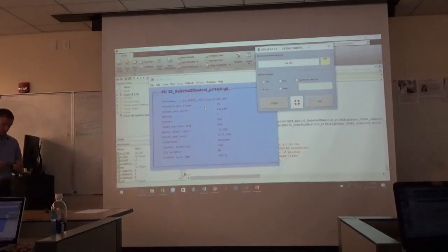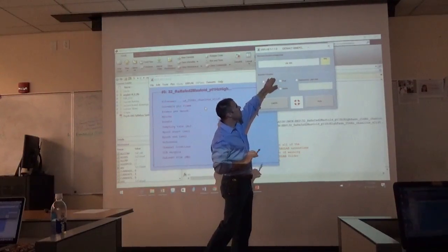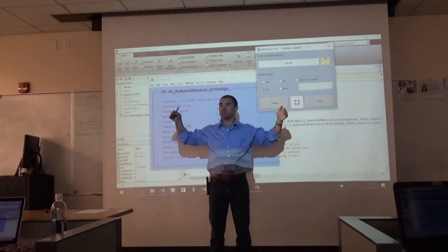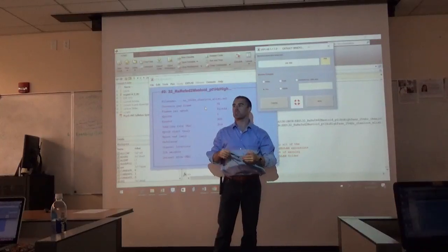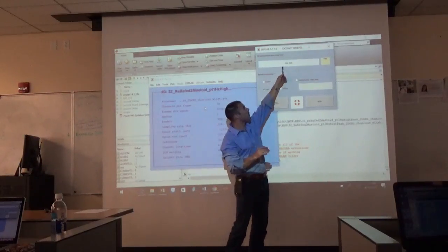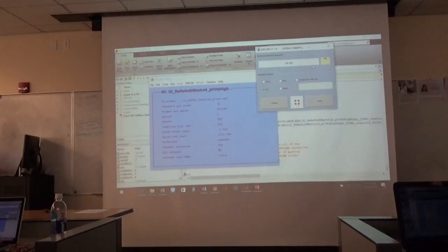Now, let's say we want to extract our bin-based epochs. It asks us to set the window. How much of the time frame do you want to slice into those little events? Now we have a stimulus that comes on the screen. Let's set our pre-stimulus, basically our baseline period, to the activity that was happening about -200 milliseconds beforehand. So that's what that is there, -200. Now we don't want it to go to 800 milliseconds. We want it to go to 1500. So let's fix that 800 and make it 1500. Make sure there's still a space between -200 and 1500.